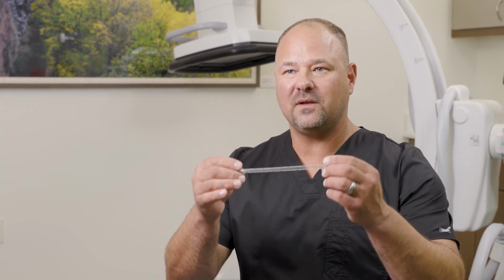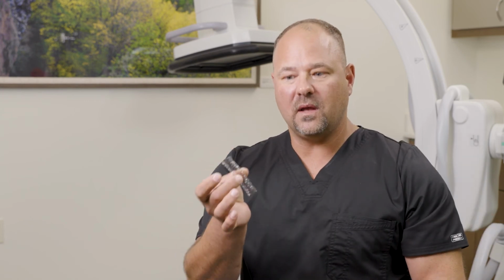A stent sounds kind of intriguing, but basically this is a stent. It's like a rolled up fence that is connected. And the stent is something that can be long, or the stent can be short. The stent can be smaller or bigger. And it just depends on what part of the body we're fixing and what stent, where it goes.